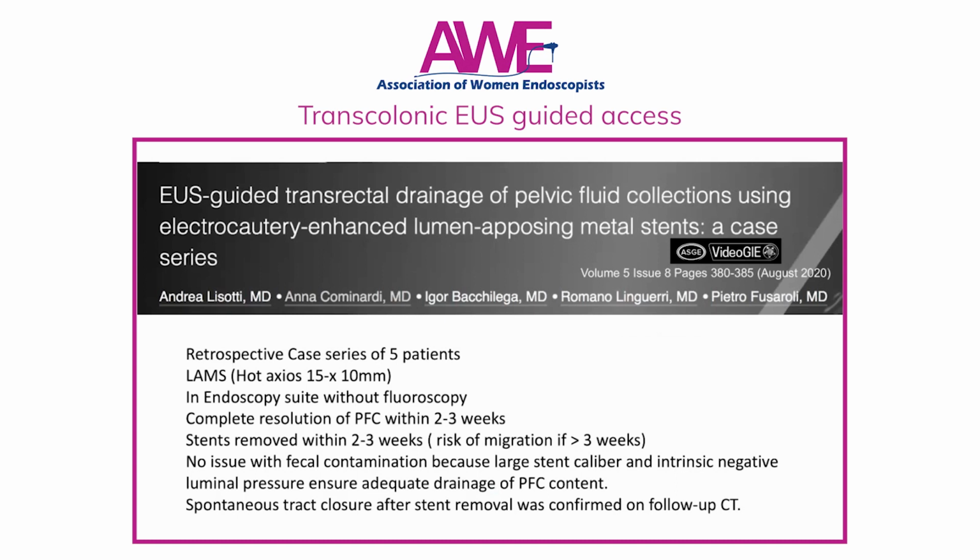So this is a retrospective case series of 5 patients where they used the hot Axios, and this was carried out in their endoscopy suite without fluoroscopy. There was complete resolution of these pelvic fluid collections within 2 to 3 weeks. Stents were removed within 2 to 3 weeks, and this is advised because of the risk of migration and embedment if left longer. There was no issue with fecal contamination because the large stent caliber and the intrinsic negative luminal pressure ensured adequate drainage. Spontaneous tract closure after stent removal was confirmed on follow-up CT.